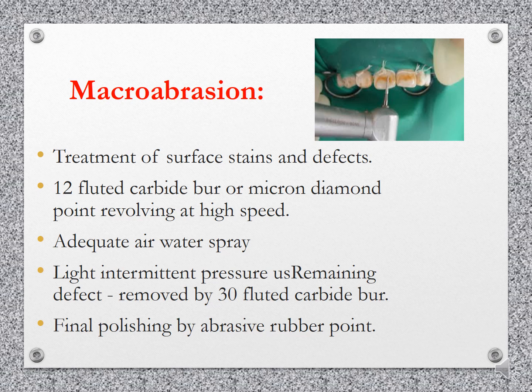Light intermittent pressure should be used. Remaining defect, if present, is removed by 30-fluted carbide burr. Final polishing is achieved by abrasive rubber point.